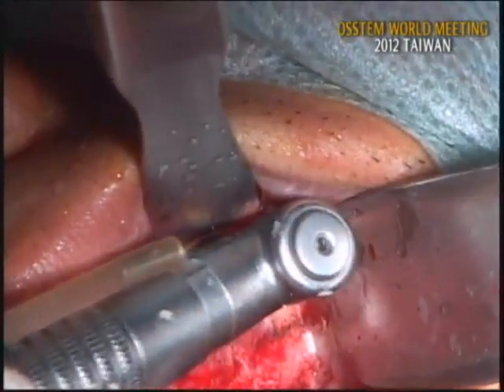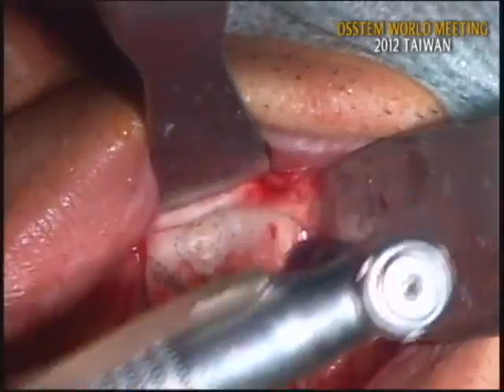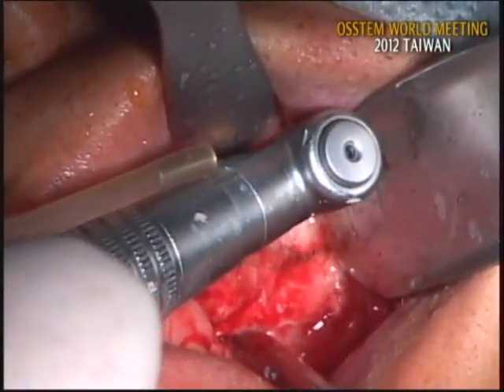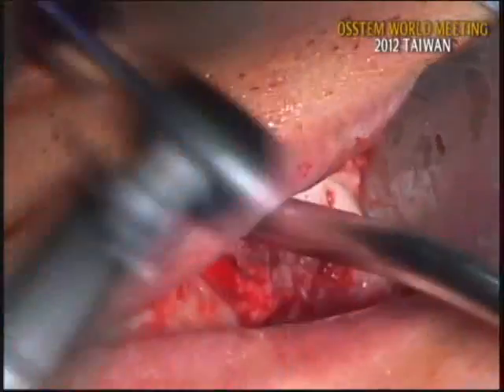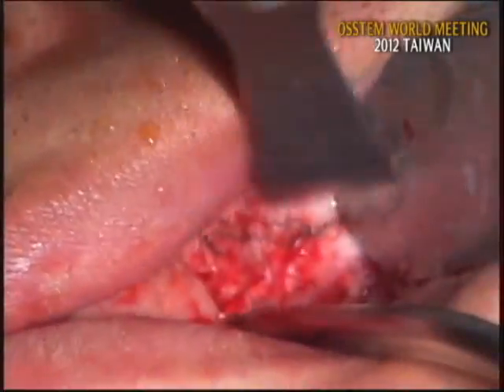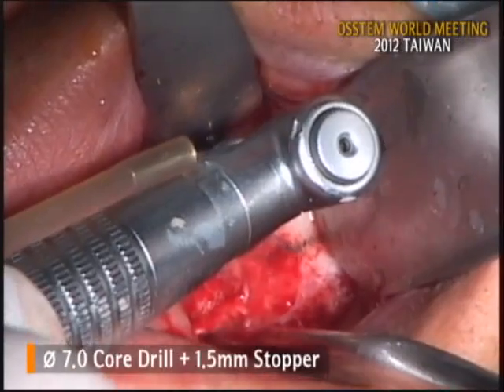With a firm fixation, let's grind the sinus wall. I think the wall is relatively thick, so 1mm is not enough. So I'll change the stopper to 1.5mm. Okay, like this, and I'll advance the last drill.